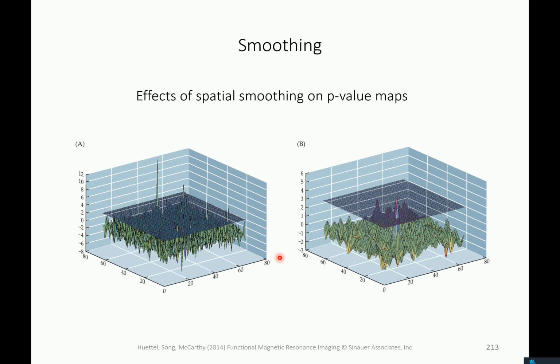The random field theory based p-values actually need a measure of smoothness. The p-values that you assign to peaks depend on the smoothness of the data, which is estimated from the data, and have been shown in some Worsley publications from the 90s to do specifically well if there's a given smoothness.